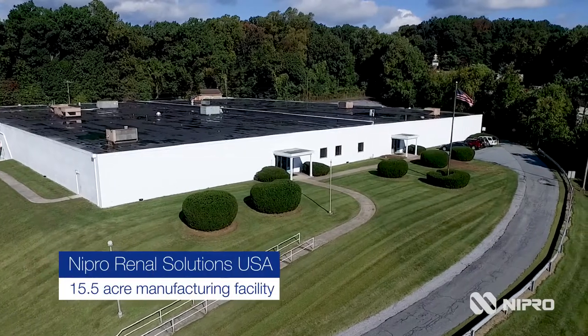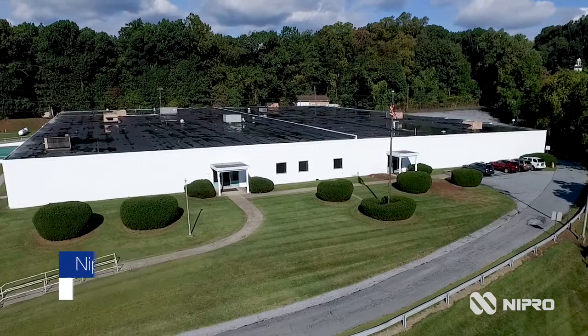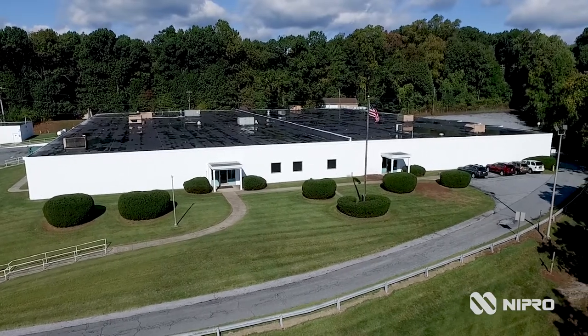Welcome to Neepro Renal Solutions USA. Our plant is located on 15.5 acres in South Central Pennsylvania, where we manufacture our first-class Medica Pure and Medica Light acid and bicarbonate hemodialysis concentrates.